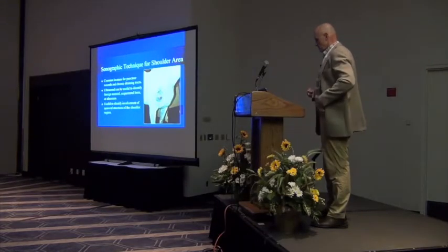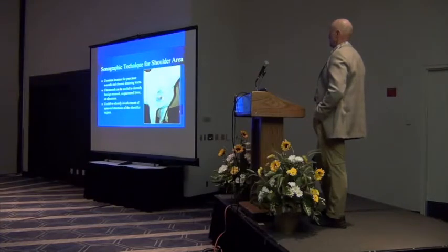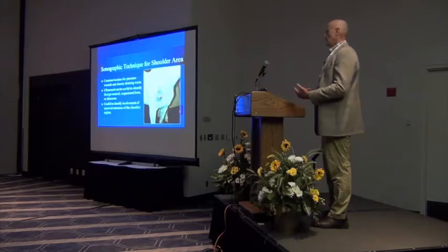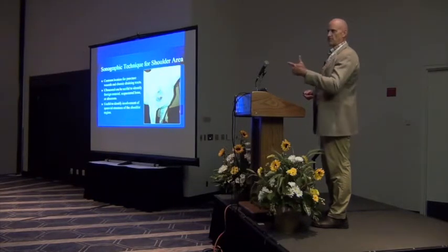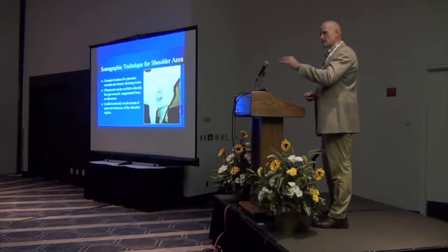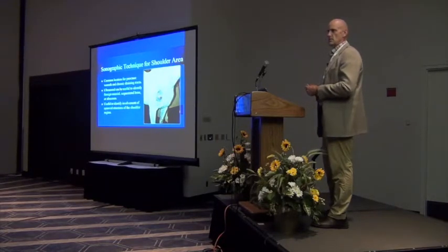So what sorts of things do we use ultrasound to look for? Any kind of a puncture wound, particularly to the point of the shoulder. Stick the scanner on there and find out where it went. And the other thing that I'm going to teach you, or hopefully present to you, is don't just be limited to sticking the scan head on there. Sterile prep the wound and stick a foreign object, I use a teat cannula or something, in there to find out just where it went. Don't be aggressive, but you want to get a pretty good impression as to what's going on, and I'll talk a little bit about using some contrast medium periodically.